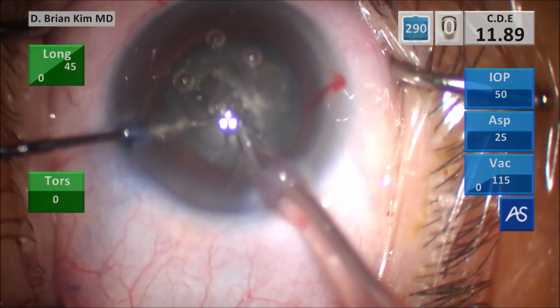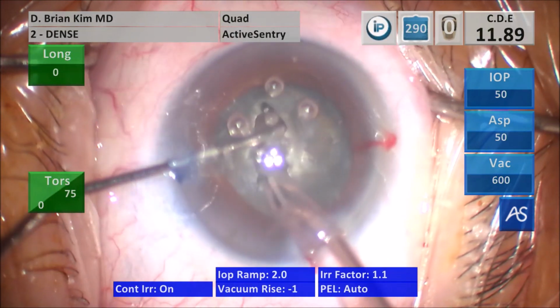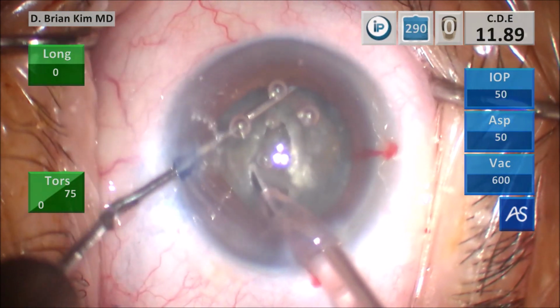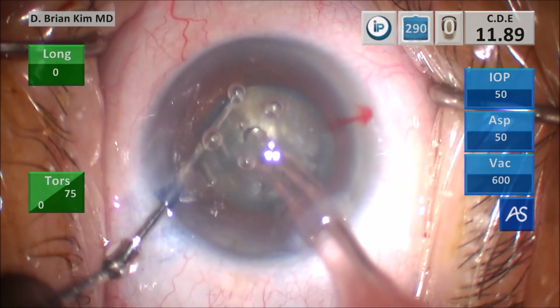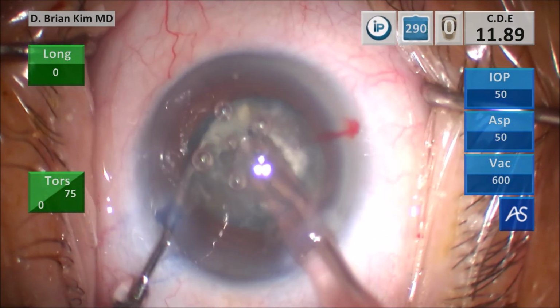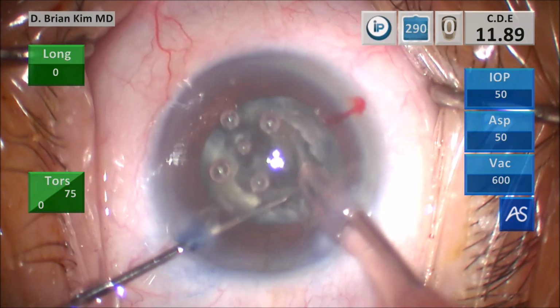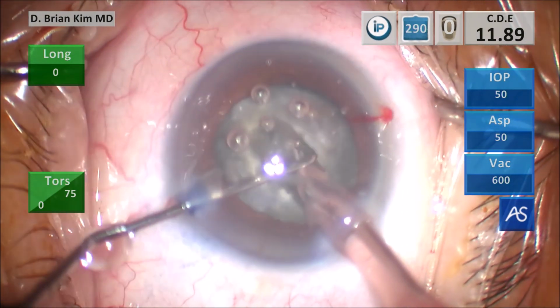I'm going bevel down and switching to quad mode, and this is the terminal chop. Place the chopper under the rhexis edge contra-incisionally, fracturing the terminal aspect of the lens. Because the terminal end is also involving the posterior lens fibers, the tear propagates all the way through, and so this really bypasses the posterior plate phenomenon.